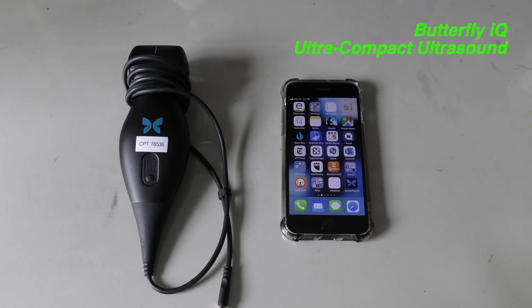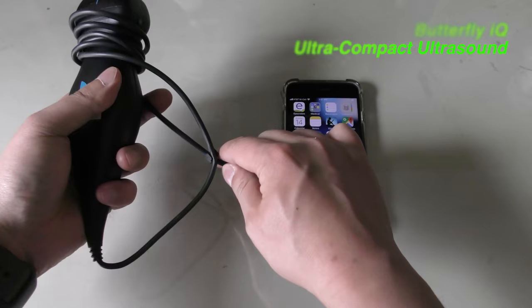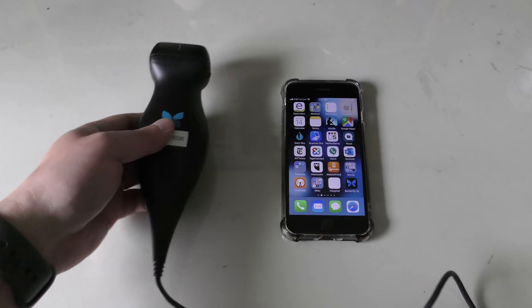The Butterfly IQ is an ultra-portable handheld ultrasound that can connect to a smartphone to display and record real-time ultrasound images. There are only two hardware pieces: the Butterfly IQ handheld itself and a smartphone.